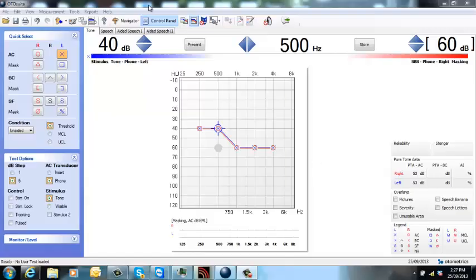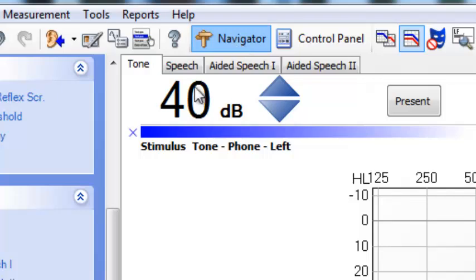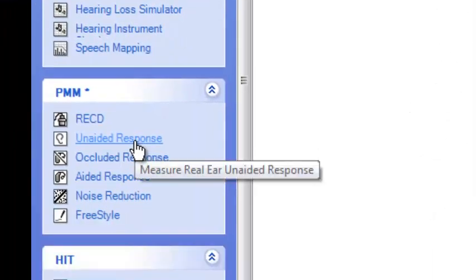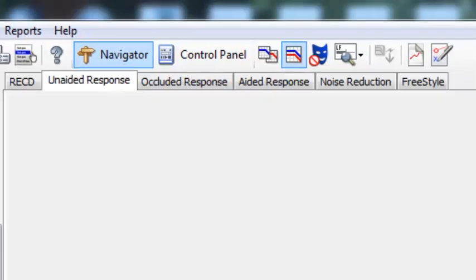Once you're in the Otosuite, which normally opens in audiometry mode, just go to Navigator, straight down to unaided response, and click control panel to connect to your FreeFit.